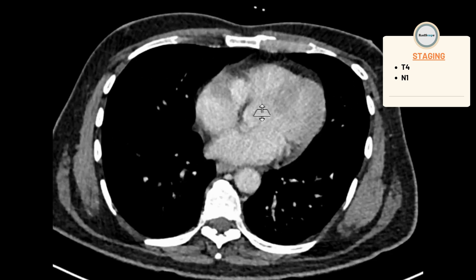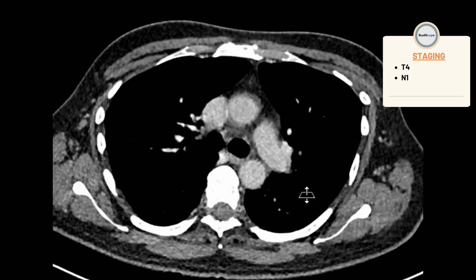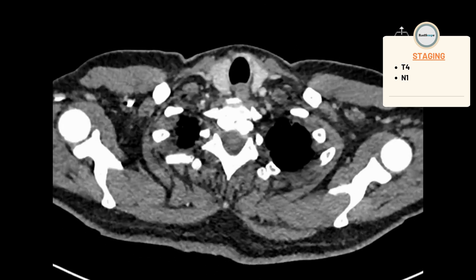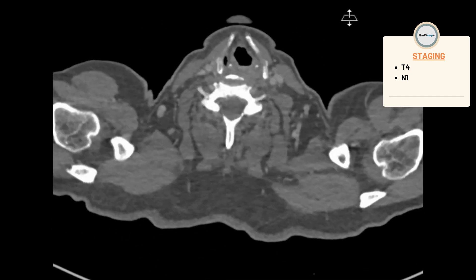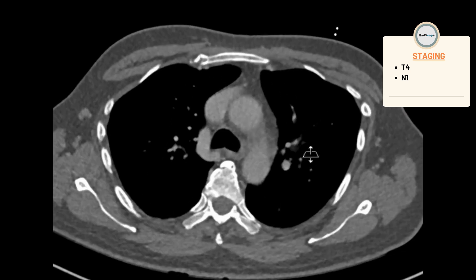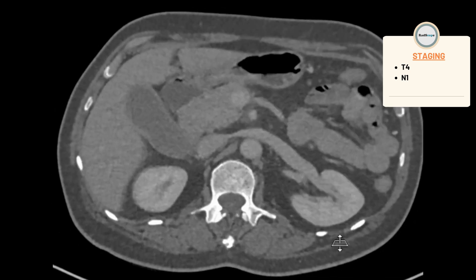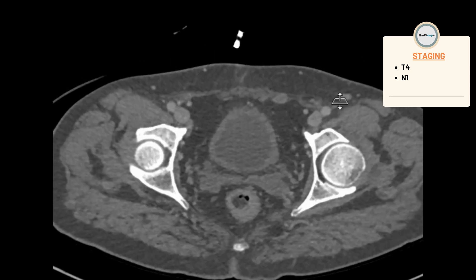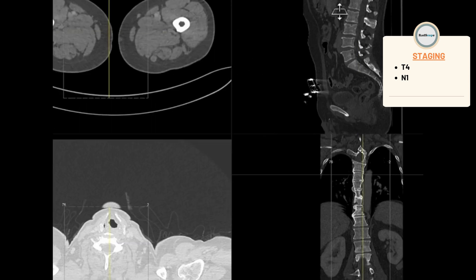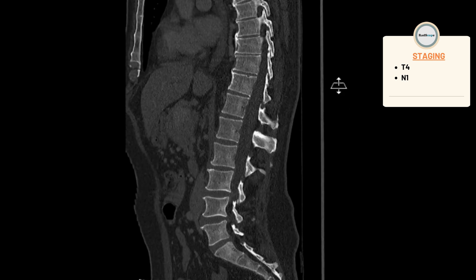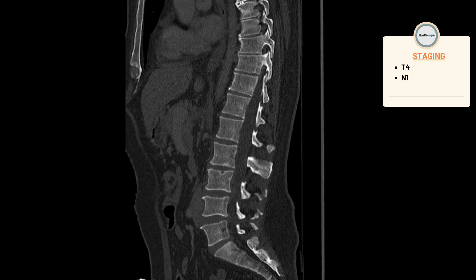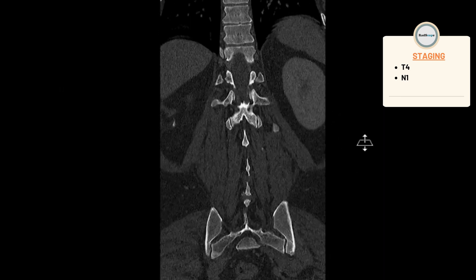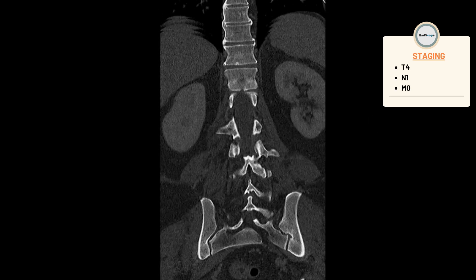I'll look at the mediastinal windows to rule out any distant non-regional thoracic lymph nodes — I don't see any. Next, let's look at the bone windows. There are no lytic or sclerotic suspicious bone lesions throughout the skeleton. It's always useful to look at the sagittal and coronal reformats — we see some degenerative changes with osteophytes and end plate changes, but no metastases. The coronal reformat is also unremarkable.